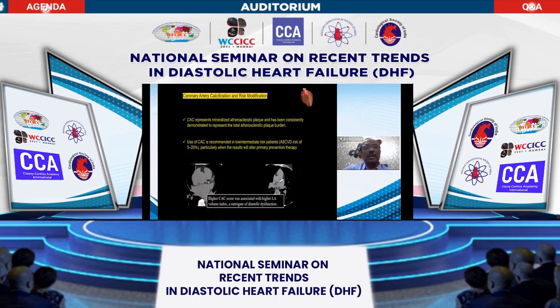Now, coming to the coronary artery calcification or the CAC score, which has been extensively studied, they represent the mineralized atherosclerotic plaque and have been consistently demonstrated to represent the total atherosclerotic plaque burden.